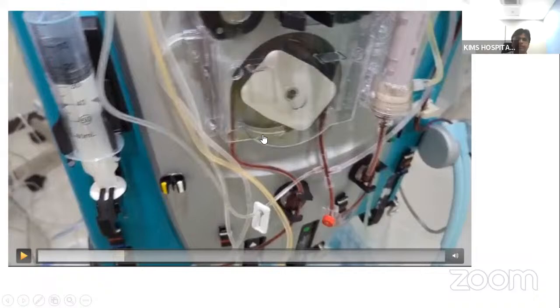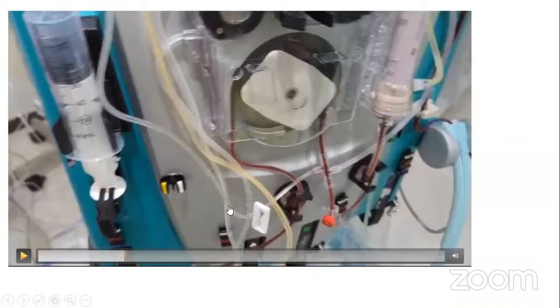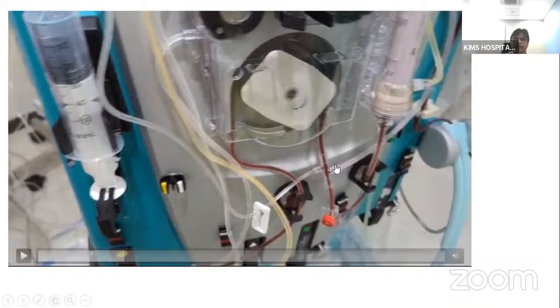Once the blood passes through the blood pump, we can see these two tubes entering into a single tube. This is the anticoagulation syringe, which will be connected here, and this is the place where the pre-filter replacement fluid gets added. Then the blood circulates through this part, which is the filter pressure gauge. It measures the amount of pressure required to pump the blood into the filter. This is a pre-filter sampling port, which is helpful if we are considering citrate anticoagulation.